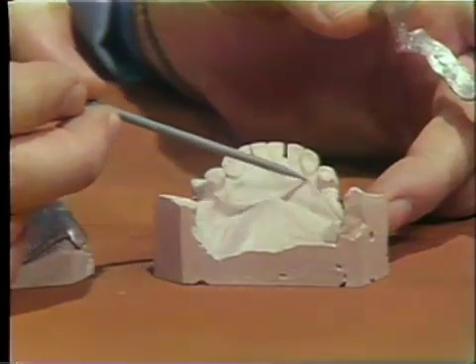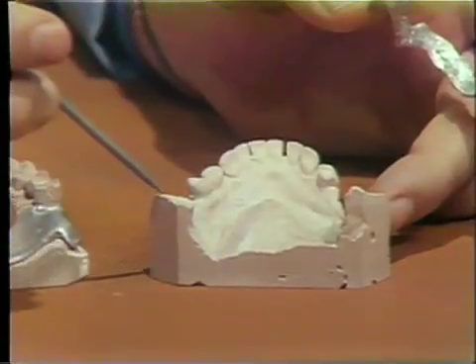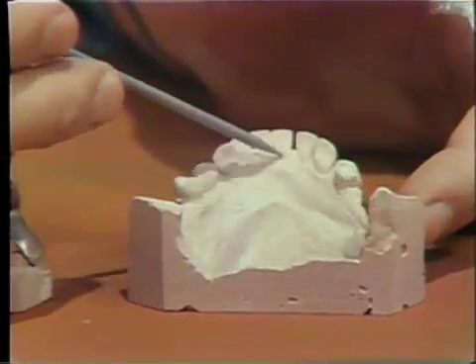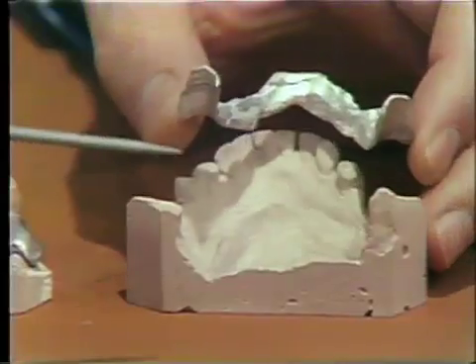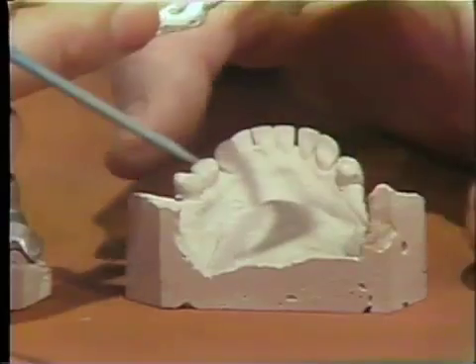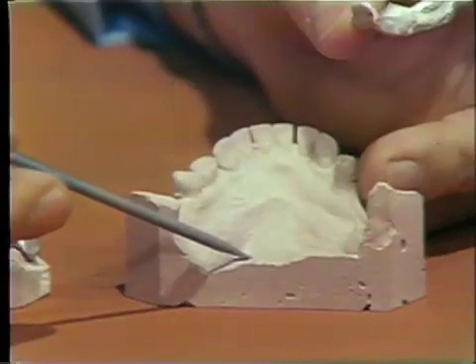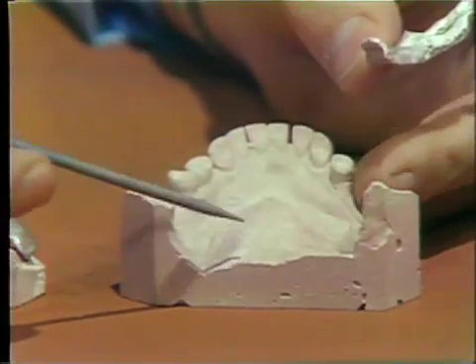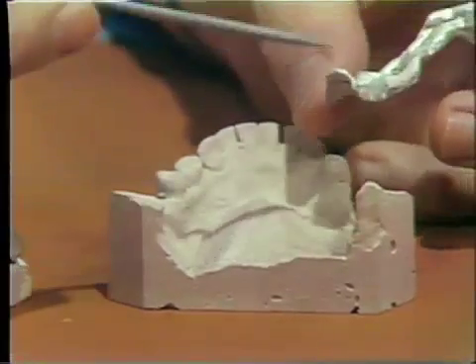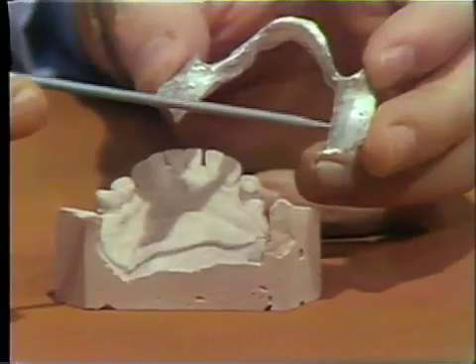A piece of pink baseplate wax is adapted to the ridge area on an impression to act as a relief, and then two more thicknesses of pink baseplate wax are built on top of this. This is then invested in a partial denture investment material and invested in a larger partial denture ring. Then it is heated to 1300 degrees to get a proper burnout, and then that mold is cooled down to 400 degrees.